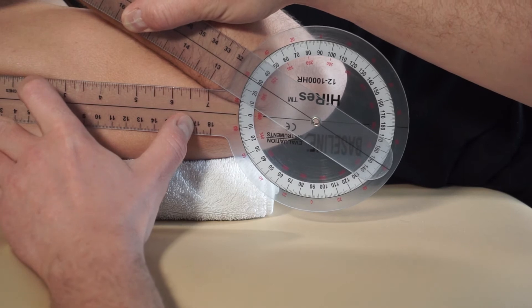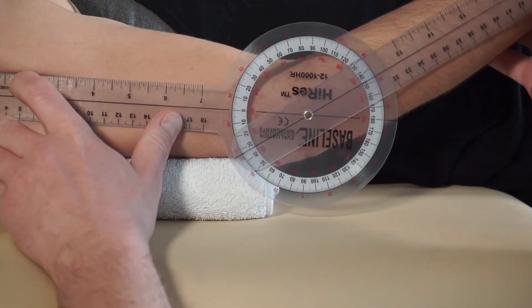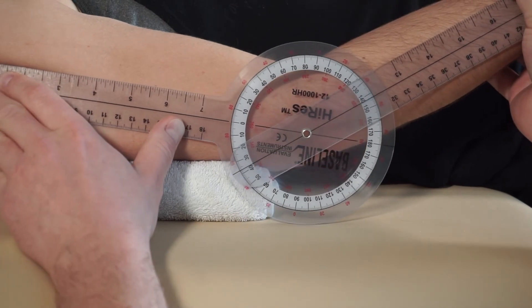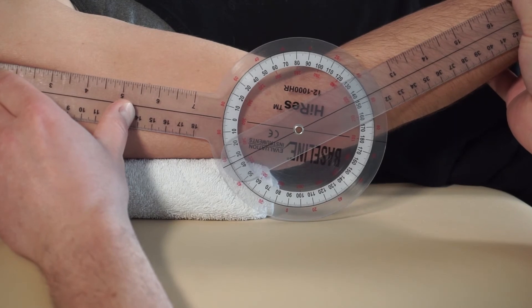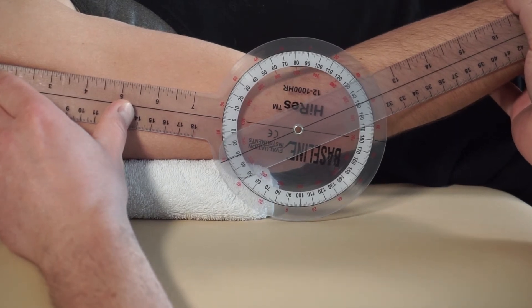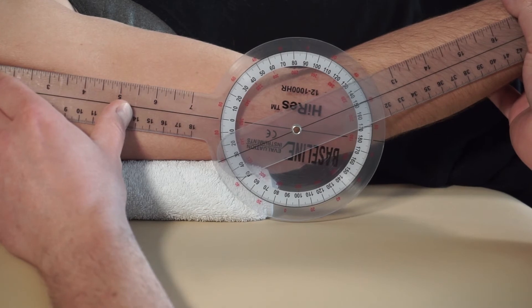Now go ahead and extend but be stiff for me — so this is not real, just for demonstration purposes. If that's all she's got actively, I'm going to apply a little force, and right there it starts to get firm. She's lacking 30 degrees of extension.